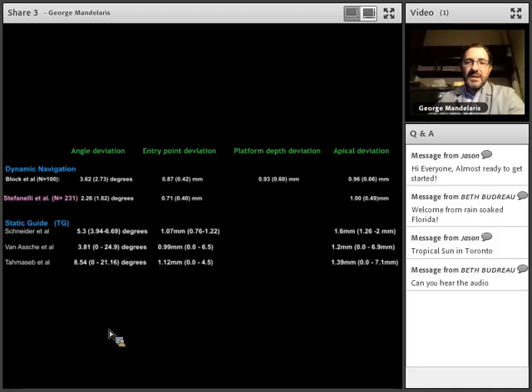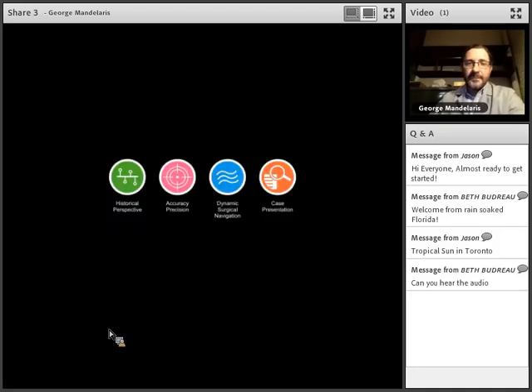So in the aesthetic zone for me, hands down, this is the way to go. Real-time verification and validation of positional accuracy, that's the trajectory of the profession, that's where we're headed. We'll need more studies to verify and validate, but they're on their way. And this is a really exciting time to be part of the Navident team.